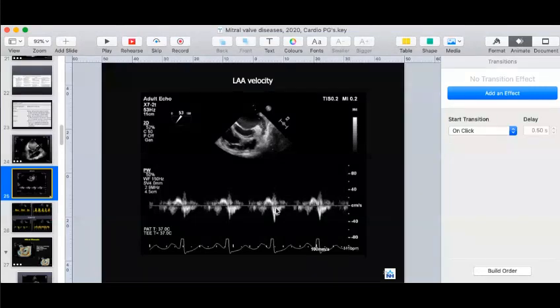Now at this point here, the systole starts. During systole, LA starts to act as a reservoir, and this is where the filling starts to happen. This is the filling velocity here. Emptying velocity, filling velocity. So this is after the QRS. This is where the systole starts at this point. Is it okay?